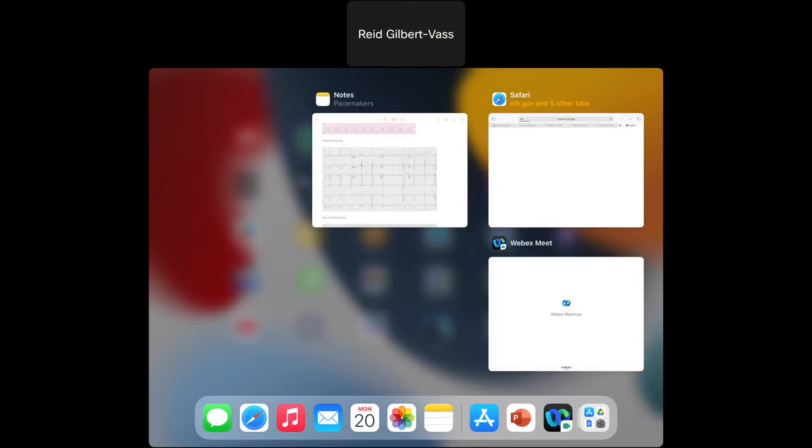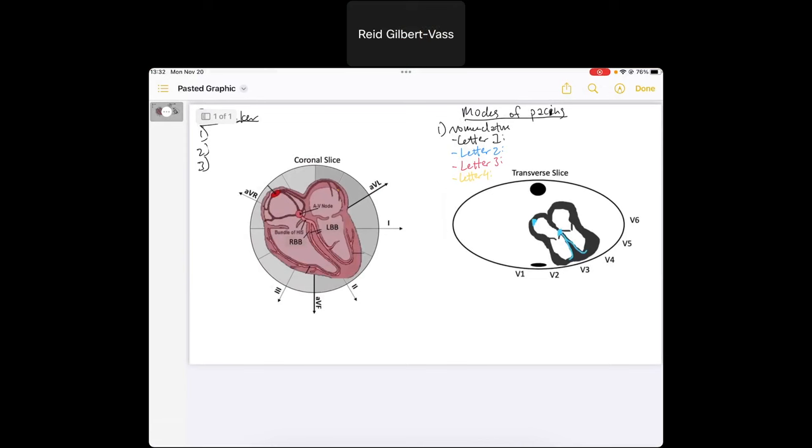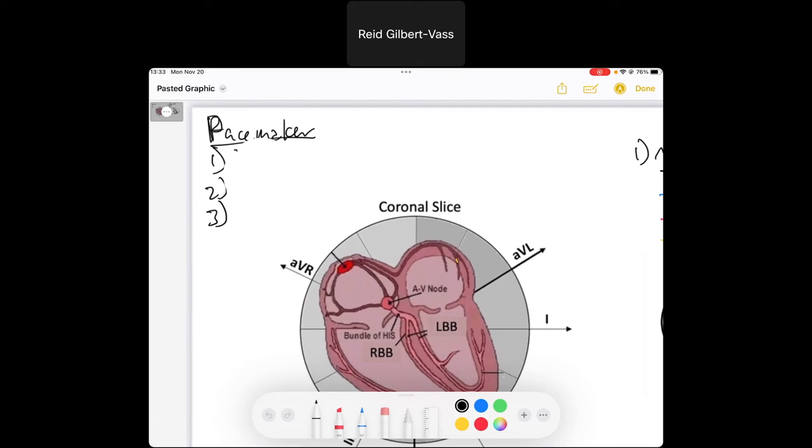Today we're going to go over pacemakers. We'll do a broad overview of the types of pacemakers we need to know about, some general understanding of how they work, and how we can identify the pacemaker and pacemaker mode on an EKG. Let's start by going through the different types of pacemakers.